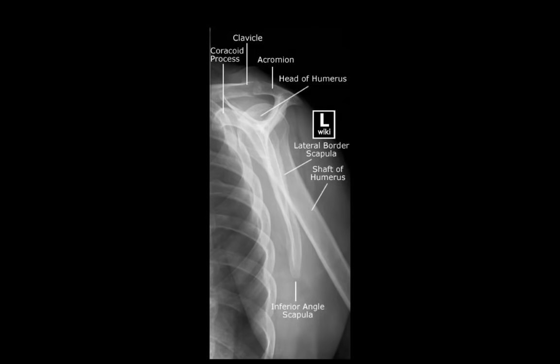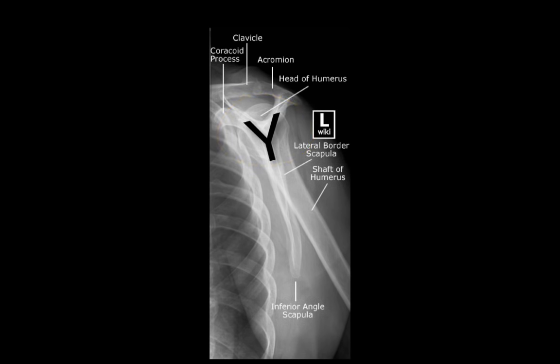Looking from the side, we get a lateral so-called Y view. We can see a Y formed by the body of the scapula forming the stem, then the coracoid process anteriorly, and the spine of the scapula posteriorly. In a normal shoulder, the head of the humerus should lie over the intersection of these three lines. If it's not overlying the intersection, then it must be dislocated. A common pitfall is mistaking the shaft of the humerus as forming part of the Y — it doesn't. The Y is formed by the scapula alone.